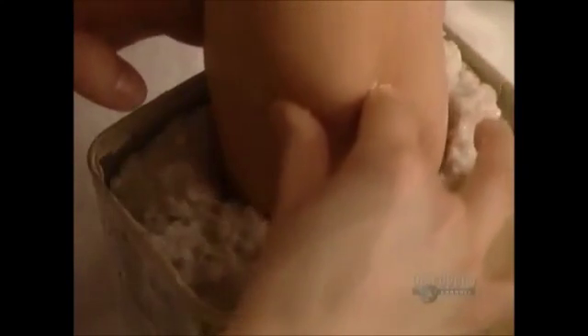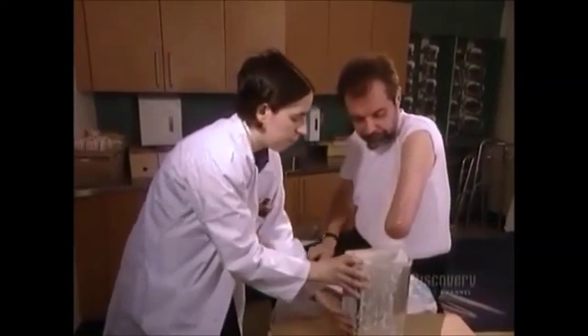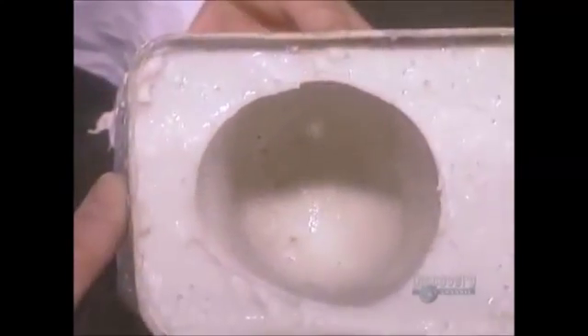Then they immerse it in algin, a gelatin-like substance that comes from algae. After about five minutes, they remove the residual limb. The algin has already begun to stiffen and maintain the limb's shape, and a couple of hours later it's stiff enough to be used as a negative mold.